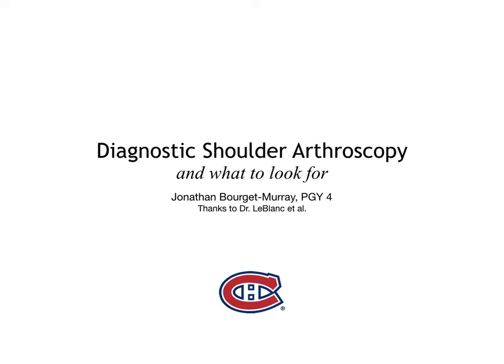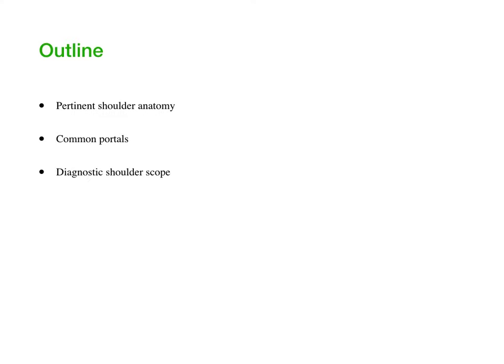Hi, this video focuses on the diagnostic shoulder arthroscopy. We'll review the pertinent anatomy of the shoulder. We will discuss some of the common portals used during a diagnostic arthroscopy. And with the help of some intraoperative pictures, we will try to review how to perform a diagnostic shoulder scope.